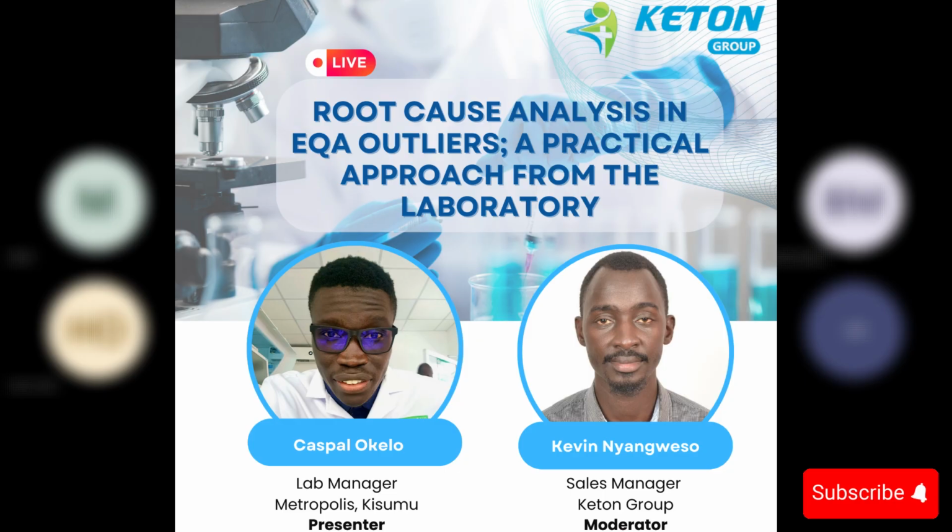Let's say I've run my uric acid. One week later, I get my results. I still have my sample. I've done my initial investigation. My submission was okay. QC, IQC was fine. Everything was fine. Then I take that sample and I do a rerun, and it's okay. Then I can conclude that that was a single isolated event, and it's random. It's not reproducible, it's not recurring, and it's not supported by any data trends. So it is random.